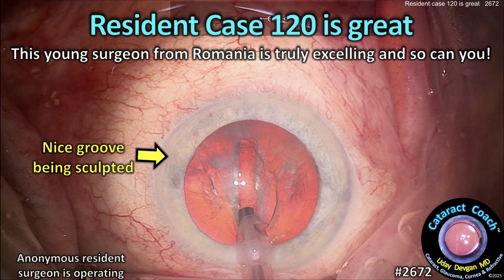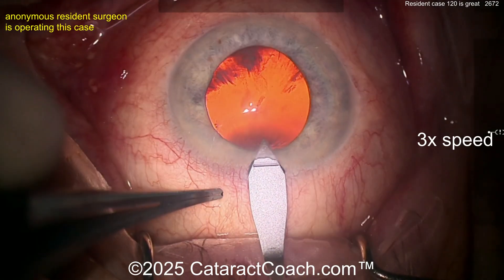CataractCoach.com resident case 120 is great. This young surgeon from Romania is truly excelling and so can you. Let's watch and learn from this case together. The video is at three times normal speed, so sped up a little bit.